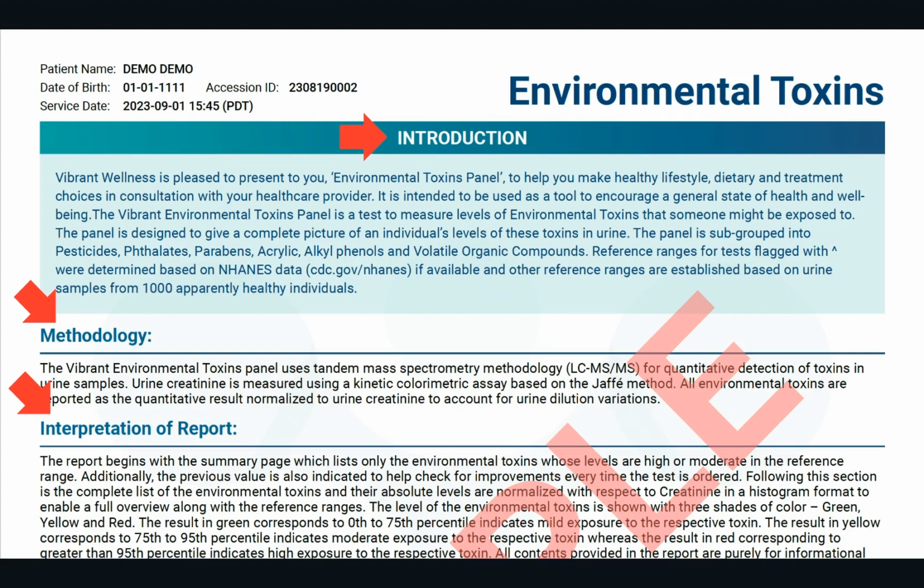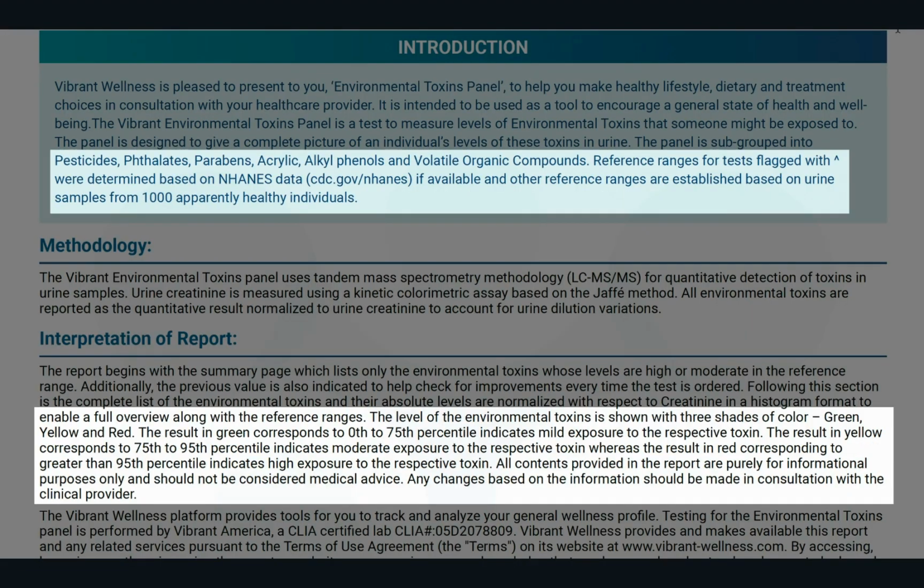The introduction page includes the methodology and interpretation of report, and I highly recommend reading this page, especially the part of the introduction where it says, quote, reference ranges for tests flagged with a caret were determined based on NHANES data, if available, and other reference ranges are established based on urine samples from 1,000 apparently healthy individuals. And also the part where it says, the level of environmental toxins is shown with 3 shades of color, green, yellow, and red, and explains which percentile each color corresponds to.